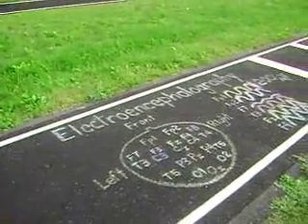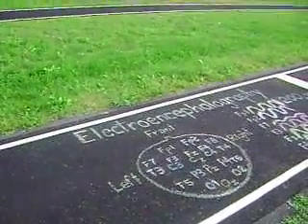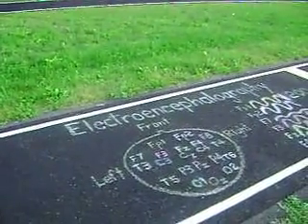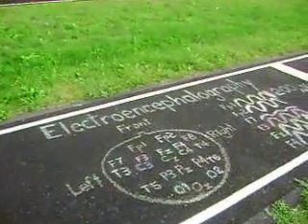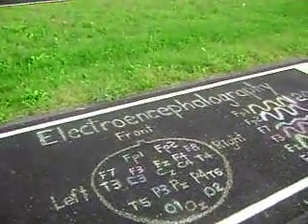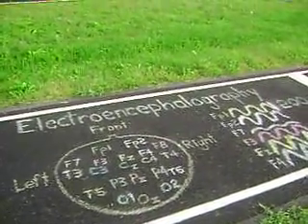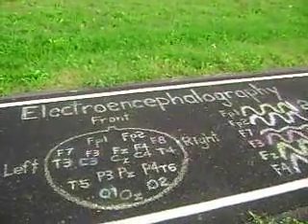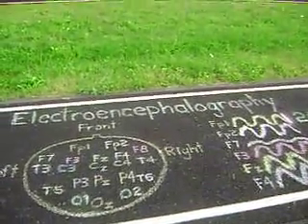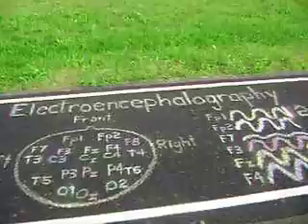Diffuse encephalopathies. The EEG has a high sensitivity for detecting globally disturbed cerebral function but is nonspecific as to origin. Exceptions include Alzheimer's disease and HIV encephalopathy, in which the EEG may remain normal until late in the course of the disease. Early changes include slowing of the alpha rhythm and the appearance of generalized theta activity. More severe cases show generalized polymorphic delta activity, frontal intermittent rhythmic delta activity, FIRDA, and lack of normal reactivity.